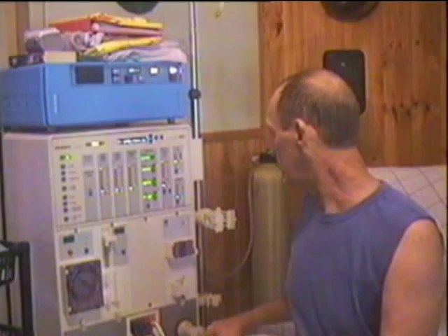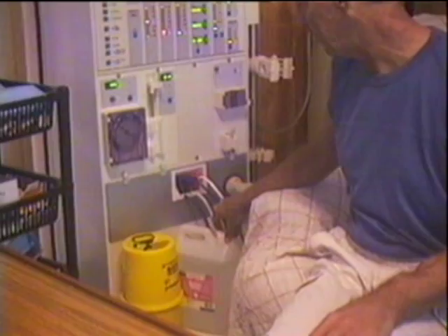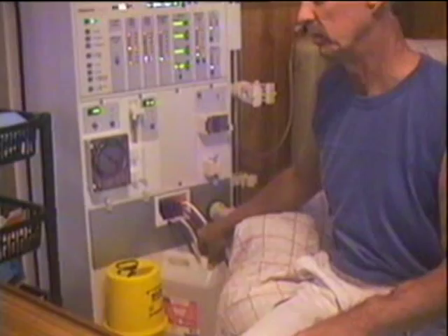What also mixes with the water is a dialysate — what they call a dialysate. The dialysate has a mixture of calcium and various elements in it. It mixes with your blood as well to keep all your chemicals in your blood correct.